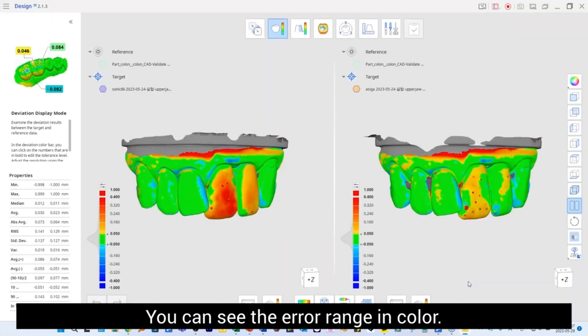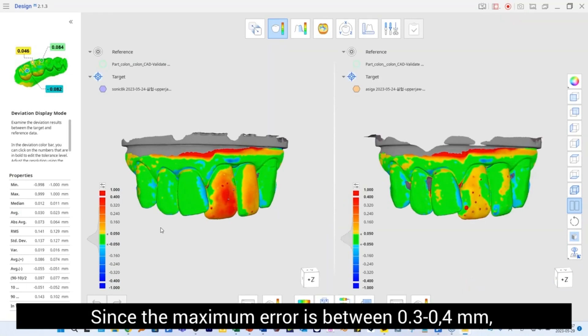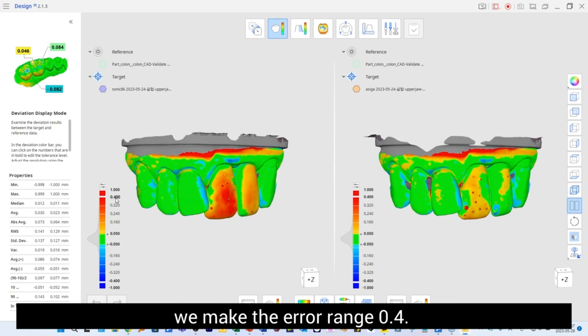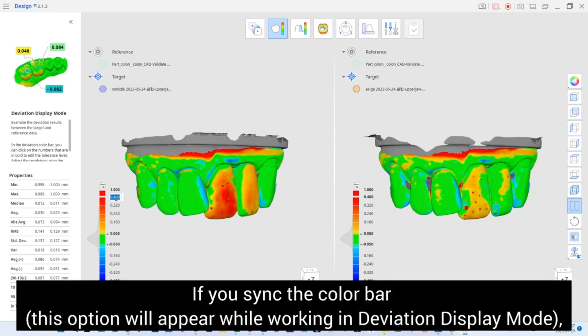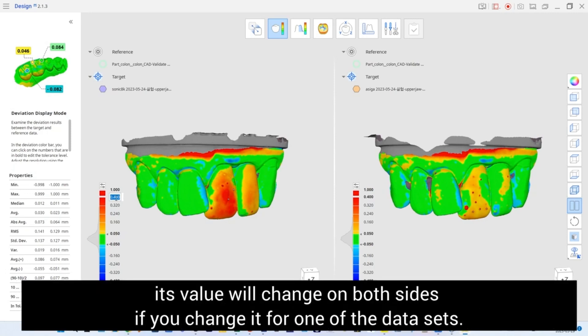You can see the error range in color. Since the maximum error is between 0.3 to 0.4 millimeters, we make the error range 0.4. We change it to 0.05 to represent the clinical tolerance in green. If you sync the color bar, its value will change on both sides if you change it for one of the data sets.